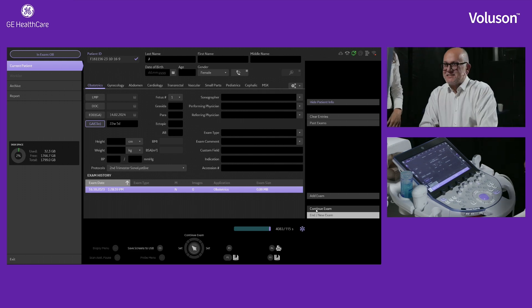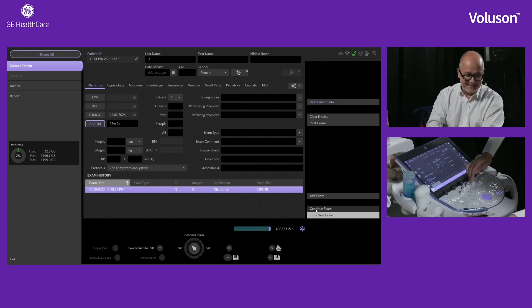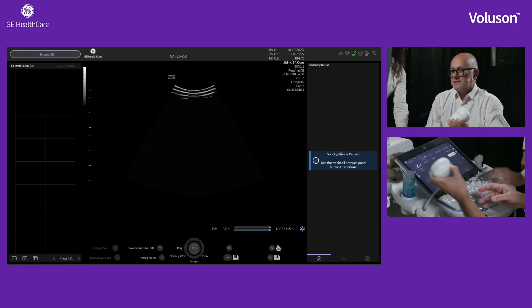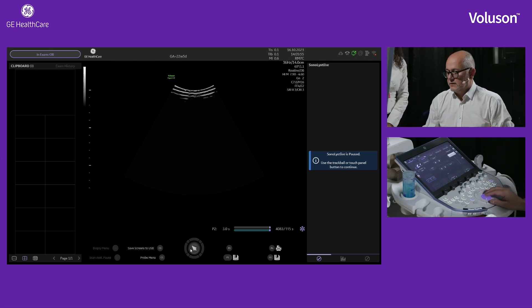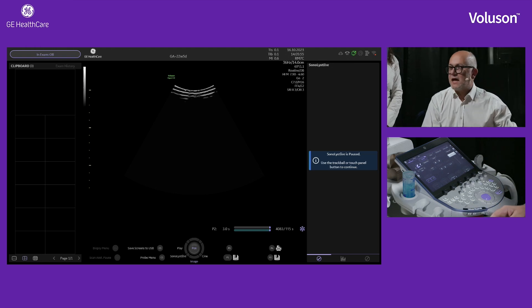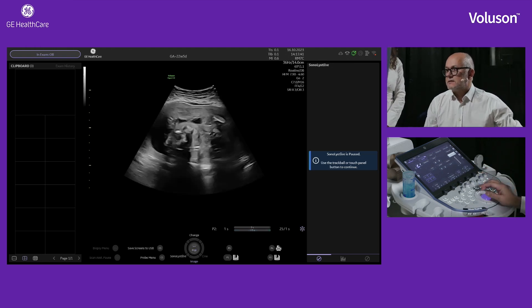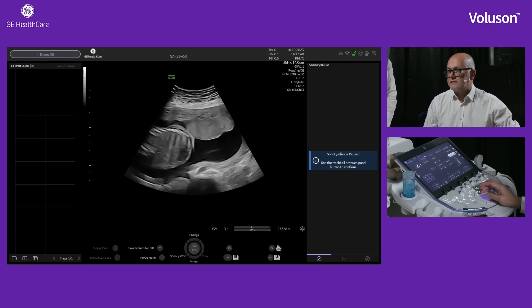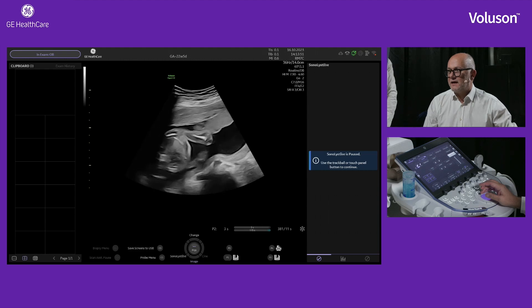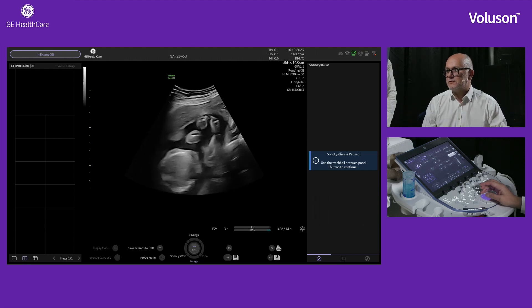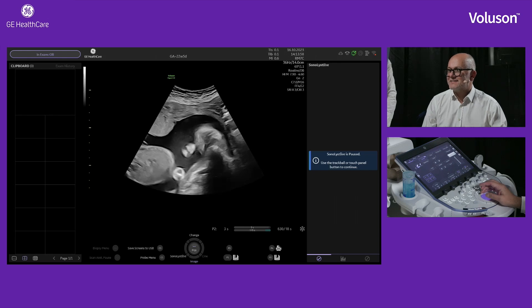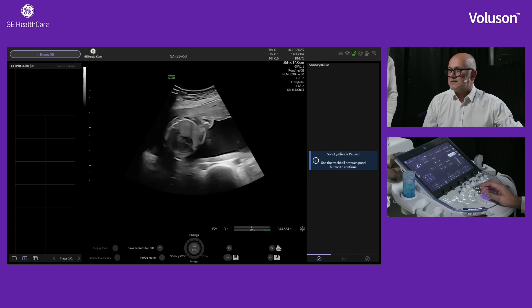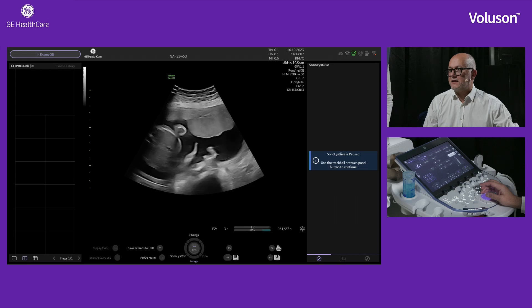This very nice lady is 22 weeks pregnant and has volunteered today to show us the baby. So here on this little wheel, you're going to see something called Sonalus Live. Let's start first without Sonalus Live just to orientate ourselves. It's a lovely baby and you can see the little heartbeat there. It's always friendly to say hello to the baby first. Baby's kind of looking at us.